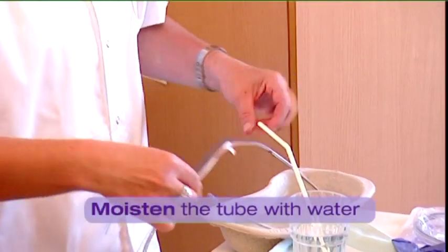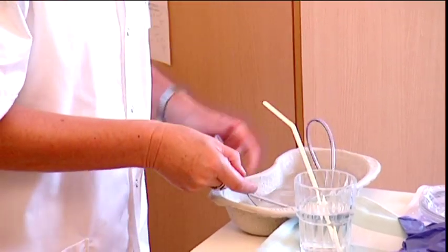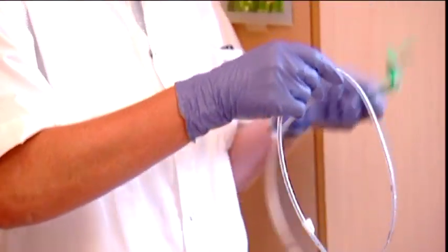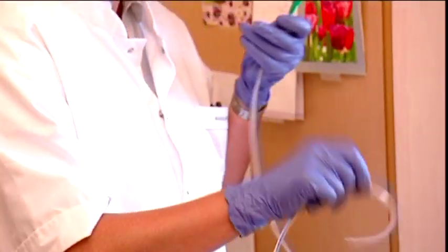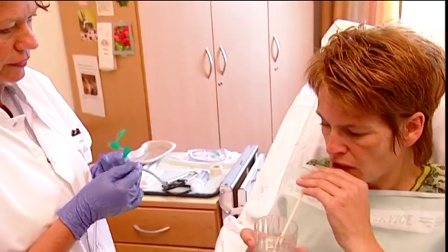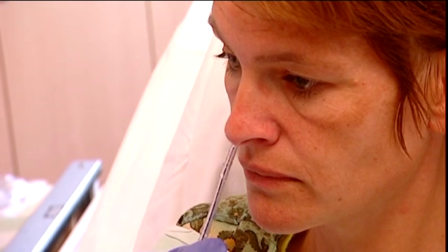Submerge the tip of the tube into the container with water — this will facilitate the introduction of the tube. Ask the patient to blow his nose and choose the nostril through which the patient breathes most easily.